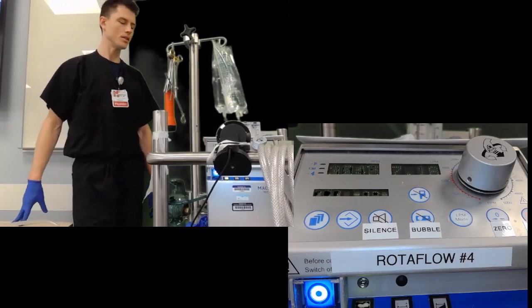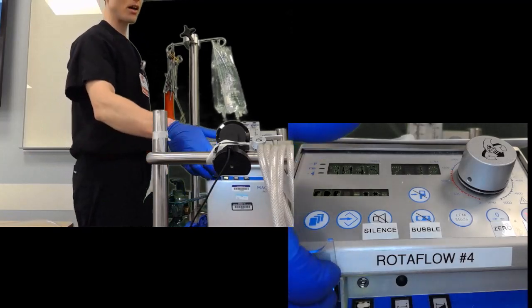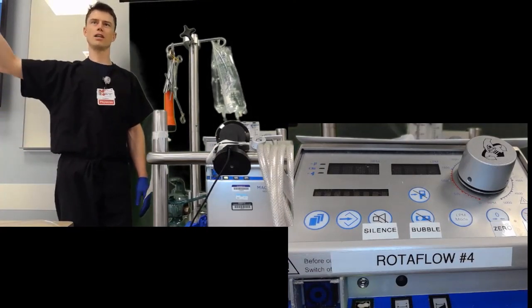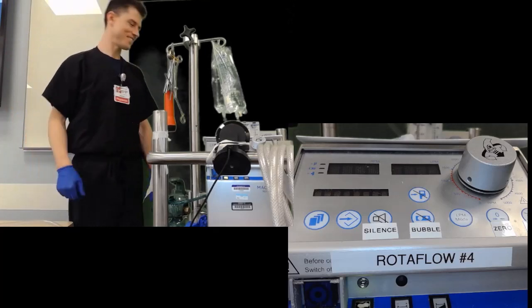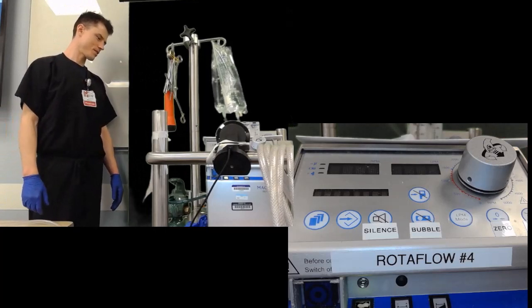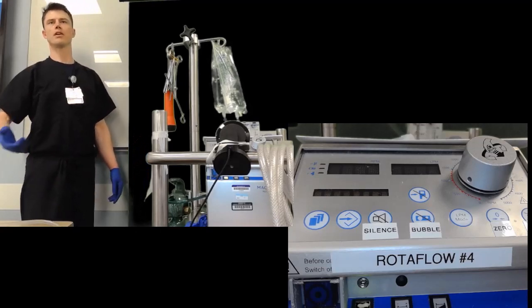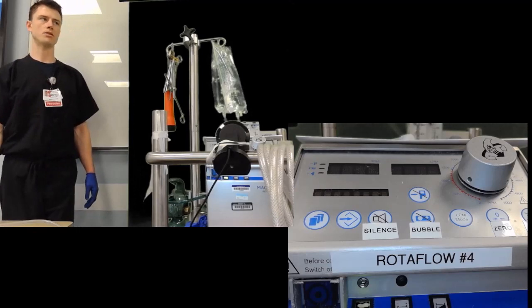All right. Okay, so let's say the battery goes out, the wall source goes out, there's a complete power failure. Patient's desaturating. 80. Hand crank. 70. All right, hand crank, come on. Okay, so in the back, there should be a hand crank on there. That's another safety check if you have a patient on ECMO, is make sure that there's a hand crank hooked up, because they may not have put the one on there.